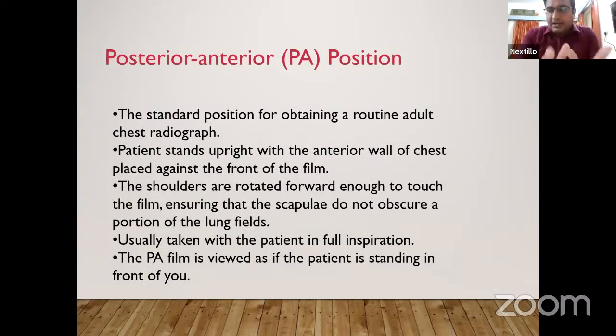First is the posterior anterior position. If you are going to see 10 X-rays in your practice, if you are pursuing medicine, whether you are going for a medical officer post or any exams, 7 to 8 X-rays out of your 10 are going to be posterior anterior position X-rays, as it is the standard position for obtaining a routine adult chest radiograph. What you normally get is a PA position. For any adult, unless there is an emergency, PA position X-rays are the best X-rays to look for lung pathology. Understood?